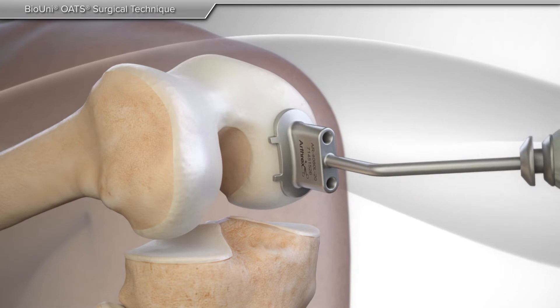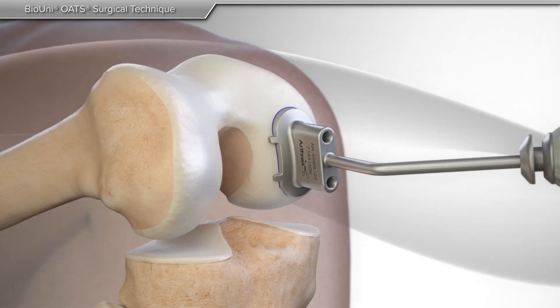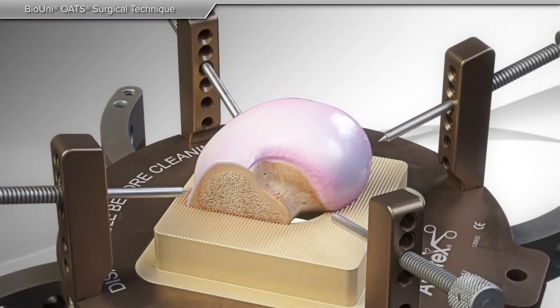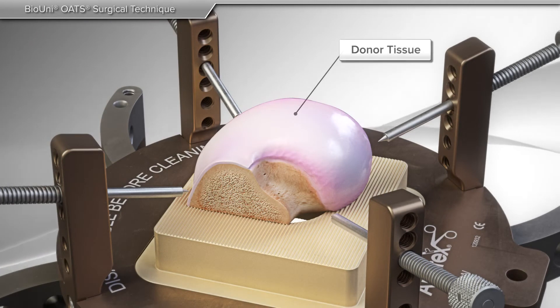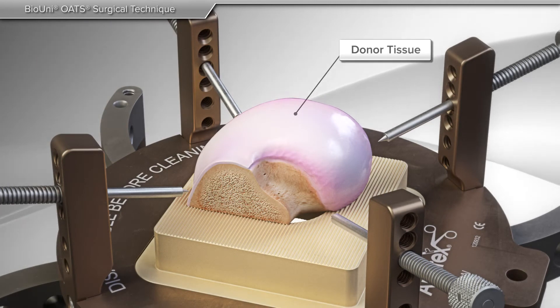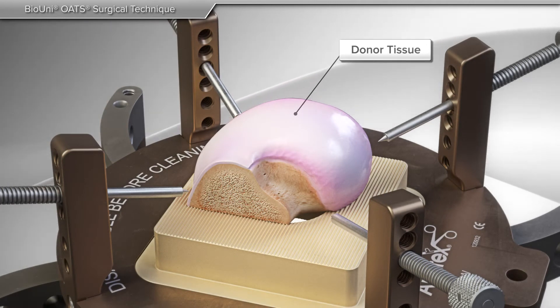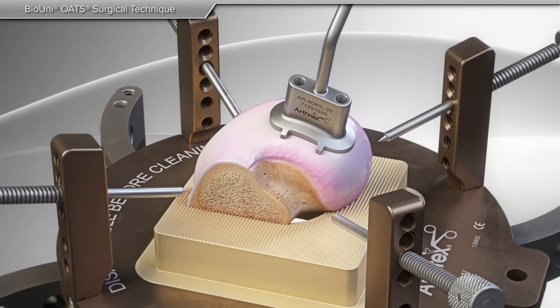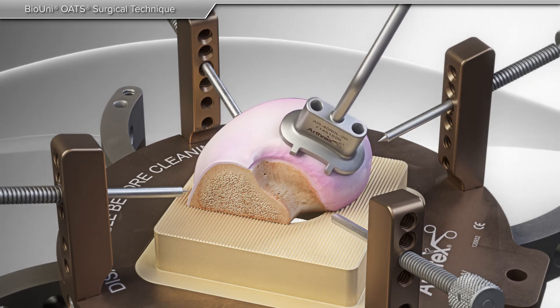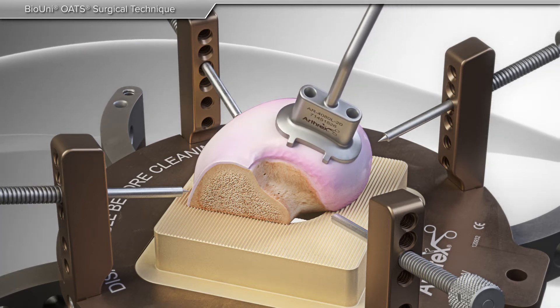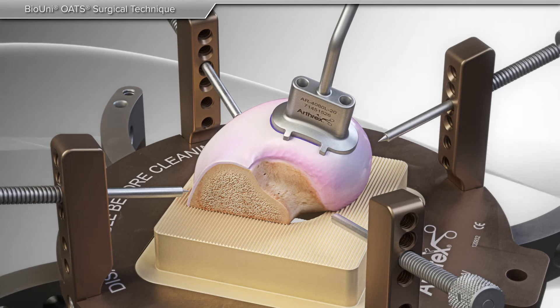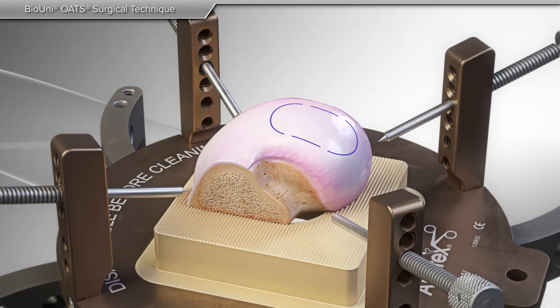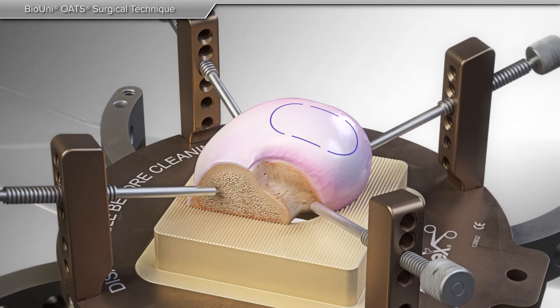Using specific oblong guides from the BioUni OATS system, your surgeon can determine the area to be treated by donor tissue. The allograft is measured and shaped to fit the dimension of the damaged cartilage and bone in your knee. In this case, the area to be replaced is irregular and oblong.